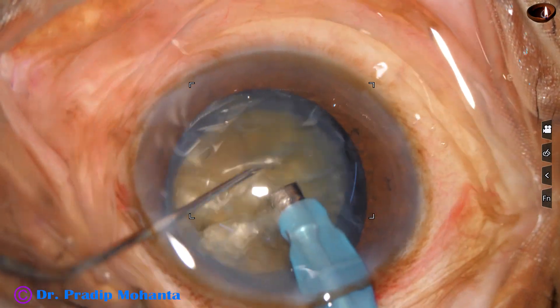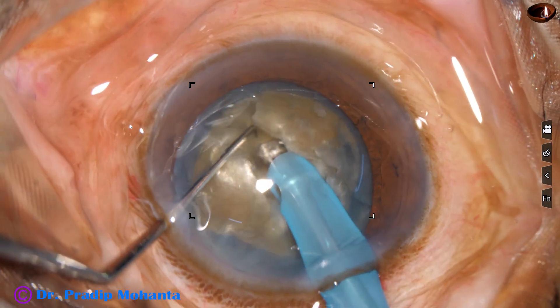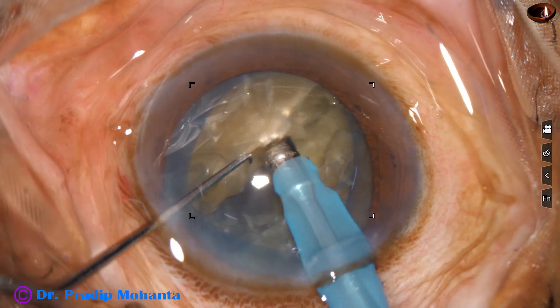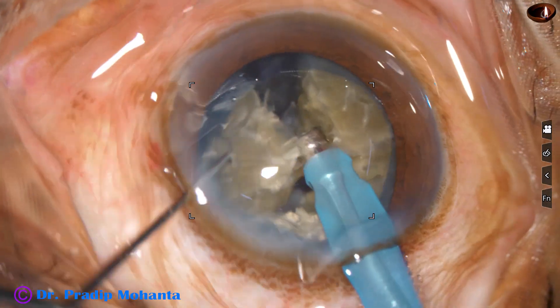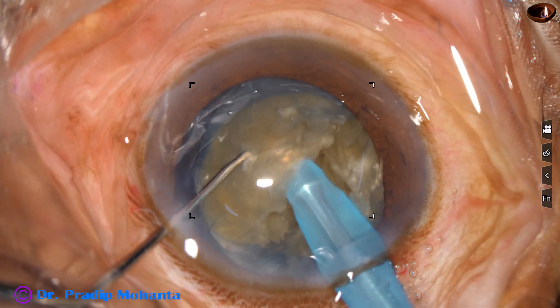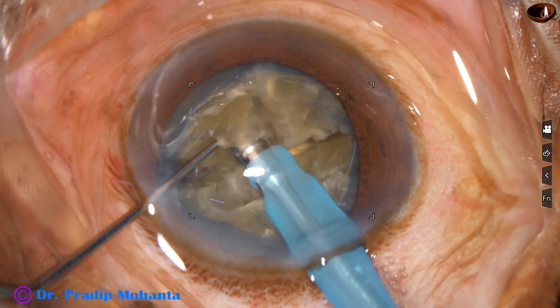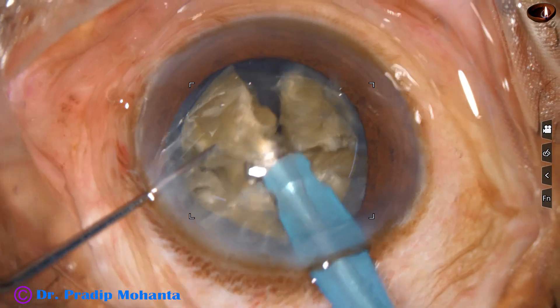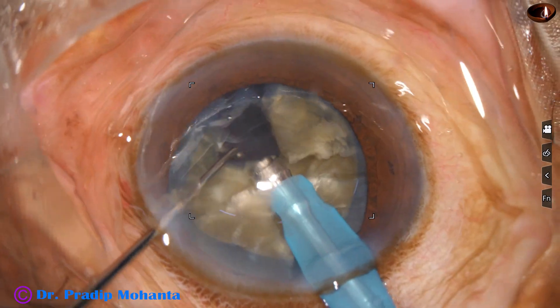Now I rotate the nucleus 180 degrees, sculpt, go to a deeper plane, and separate the two hemi-nuclei completely. Again, I go through the substance of this hemi-nucleus and chop it. When you go through the substance, the chopping is easy — I have coined a name for this: submarine chop. Each large nuclear fragment is subdivided into smaller pieces, and then the pieces are emulsified.